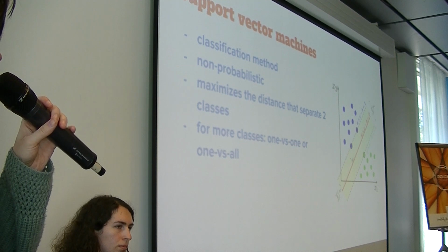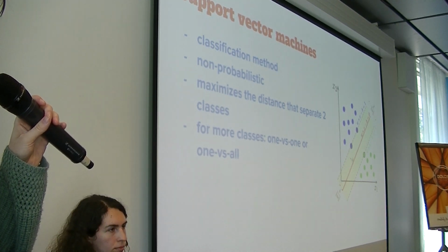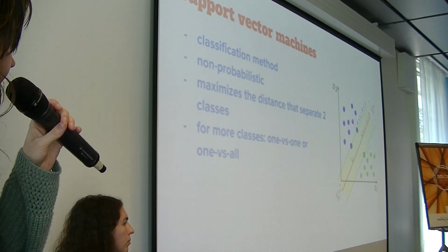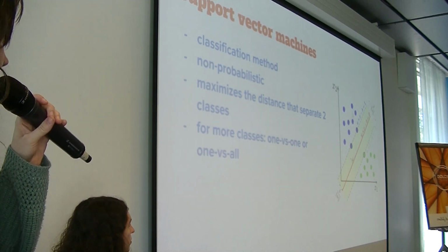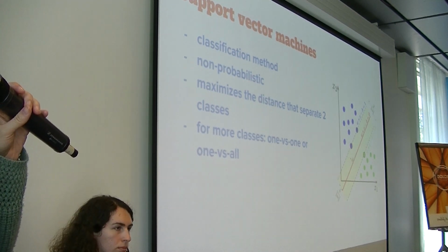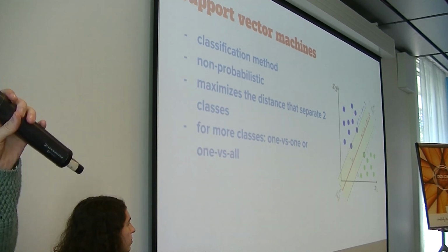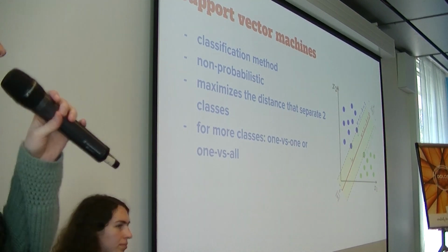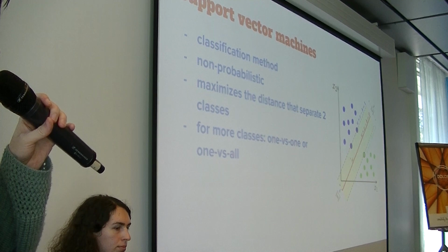If you plot all the different data points across these two features or EEG channels, you will see that the data points labeled with blue would belong to one class, and the data points in green would belong to a different class. In this case, we have a very nice separable problem where it's possible to separate the two clouds of data.